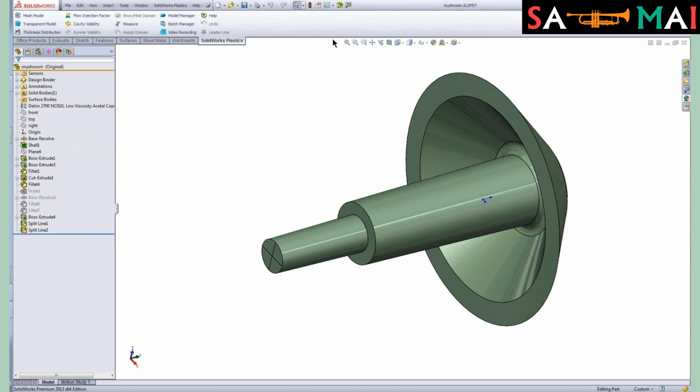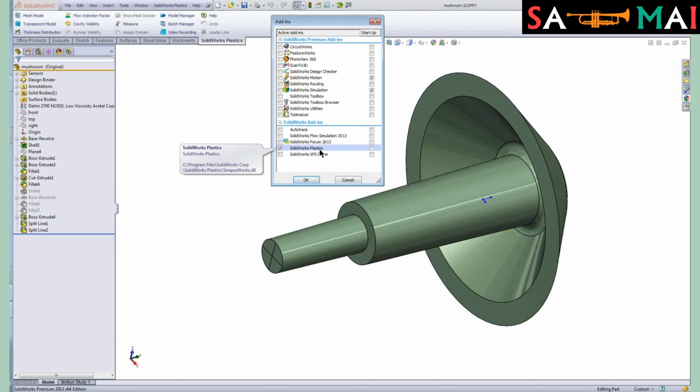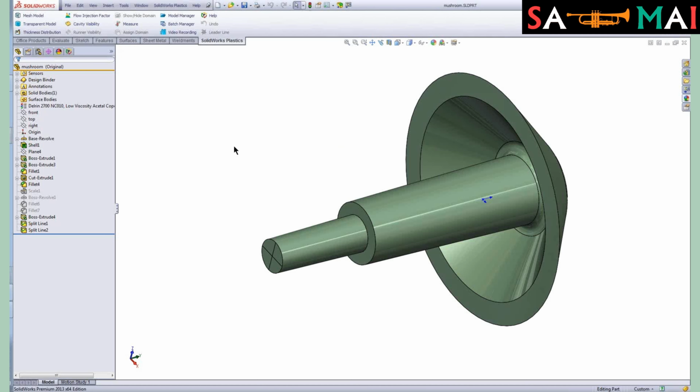The first thing that I'm going to show you is basically the SolidWorks Plastics product is just an add-in to SolidWorks. Just like all of our other simulation tools, it allows us to work directly on our designs right within SolidWorks with an interface we're familiar with. So I already have my plastics add-on turned on. From there, what it does is it gives me an additional tab on the command manager as well as an additional icon above my feature manager tree.